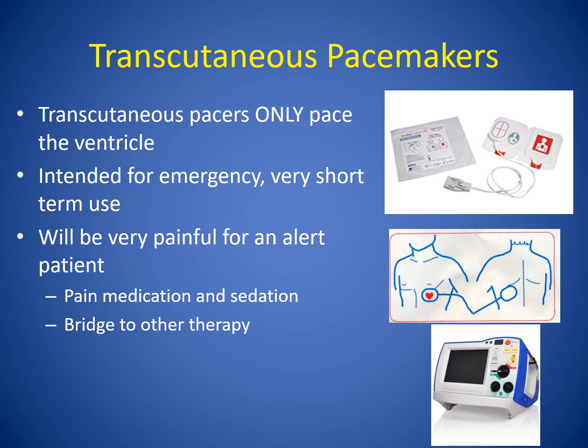In terms of a transcutaneous pacemaker, they only are pacing the ventricle, and it's used in an emergency situation for very short-term use because it is very painful, and the patient usually feels it, so we may want to consider pain medication and sedation. And as I said, it is a bridge for other therapies.